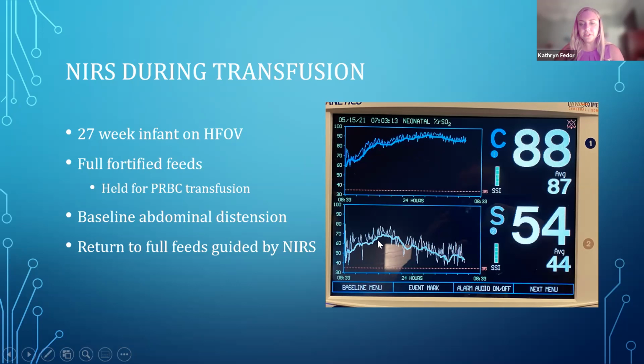But then if you watch the somatic and what happened there, the baby maintained a nice higher reading on the somatic and then dropped off towards the end of the transfusion, and certainly during that last 4 hours of monitoring. So this is a baby that we huddled as a team on, and our physician that had this baby pulled us in, and we had a good chat about what our plan was for this baby.